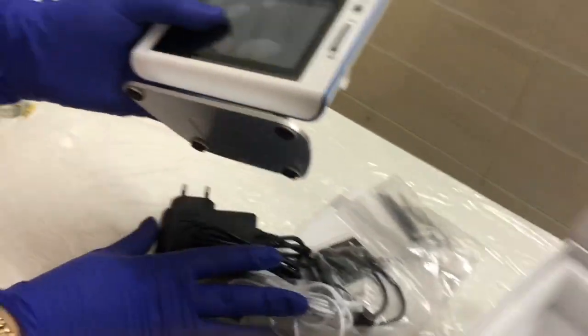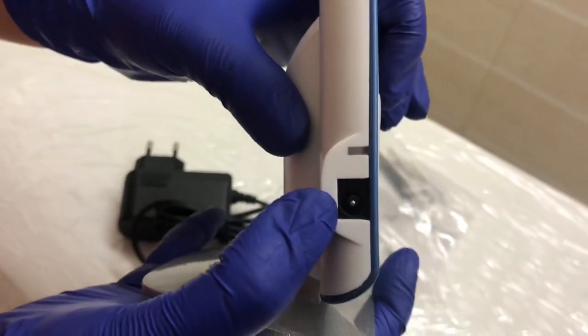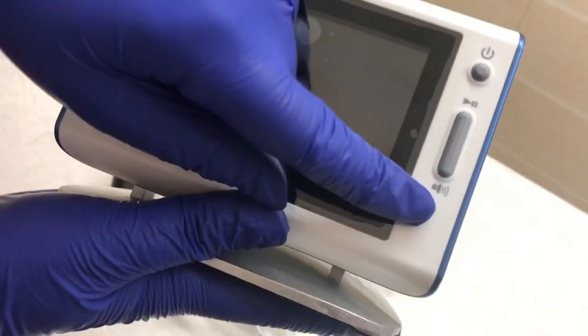Let me tell you about the LCD screen. You can see here: this is the measuring wire socket, this is the socket for the adapter, this is your power on/off button, this is your display button, and this is your sound button.